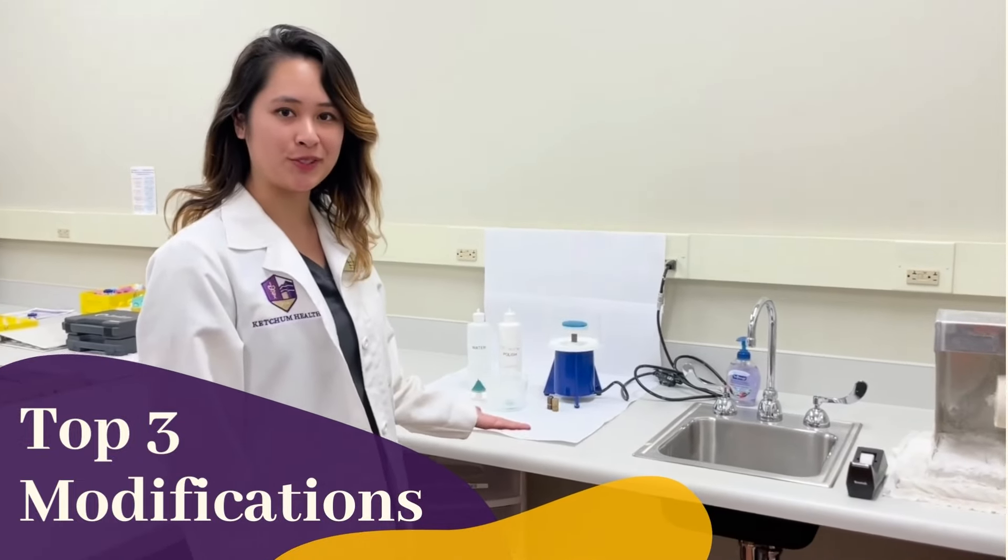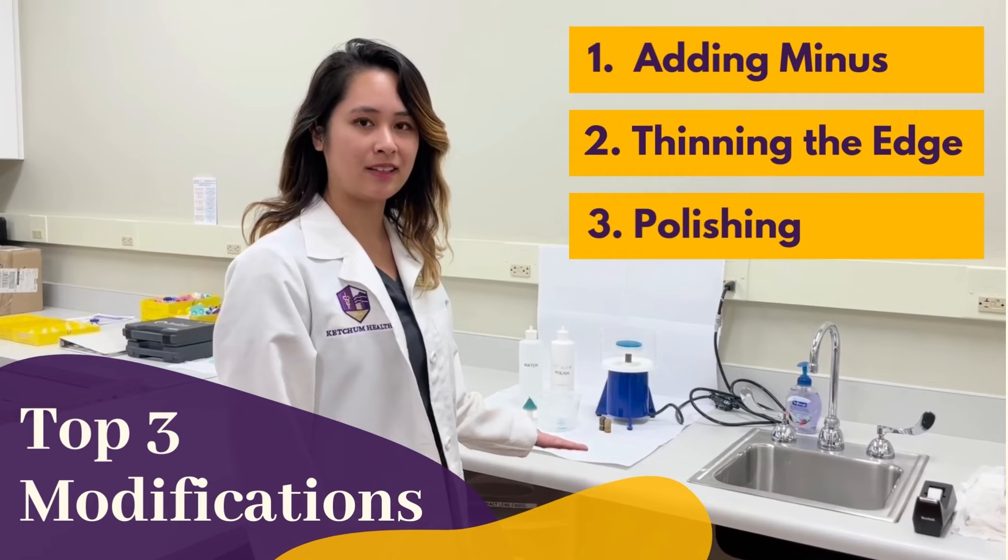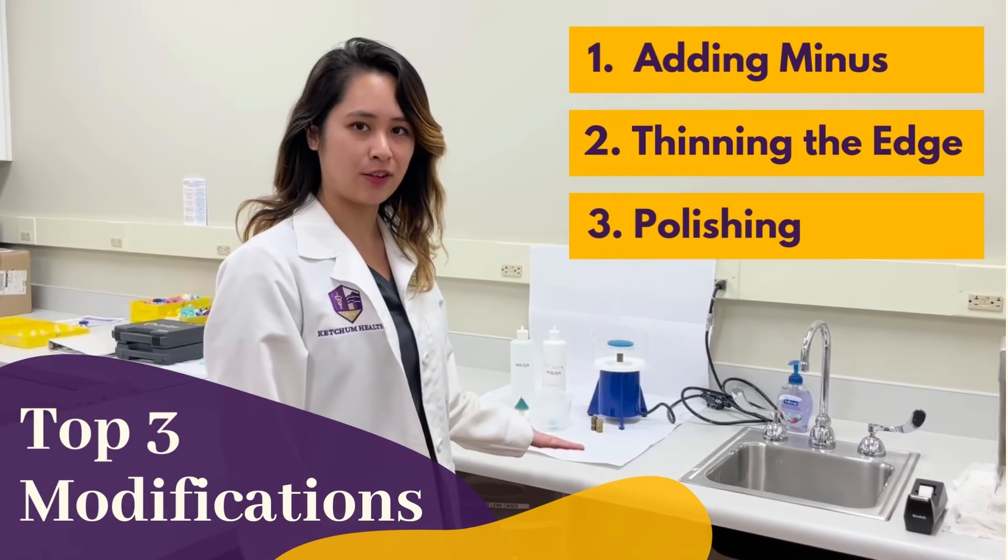I'll be demonstrating the top three uses for the modification unit. First, adding minus. Second, thinning the edge. And third, polishing.